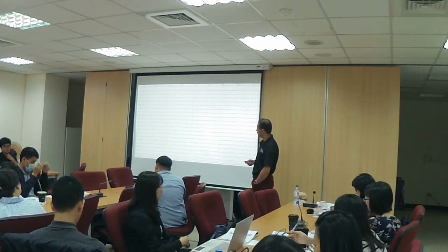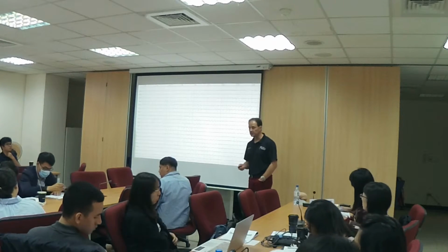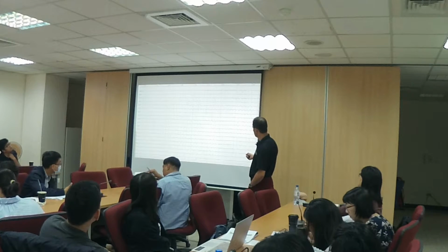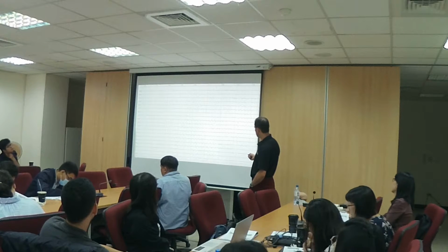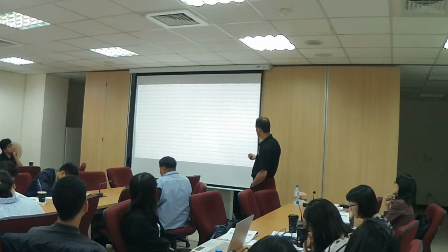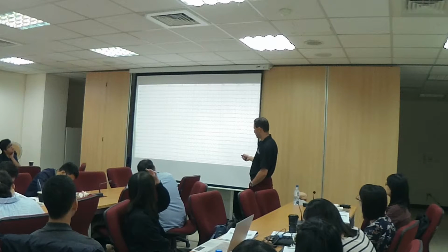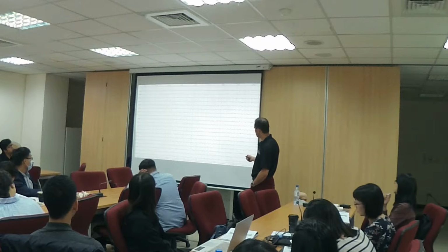So this is what theta would look like. And again, how do we know what the rhythm is? We count. 1, 2, 3, 4, 5, 6. See? 1 cycle, 2 cycles, 3 cycles, 4, 5, and 6 cycles, 6 hertz. Now, keep in mind, this is filtered, but it gives you an idea of the morphology and the range.